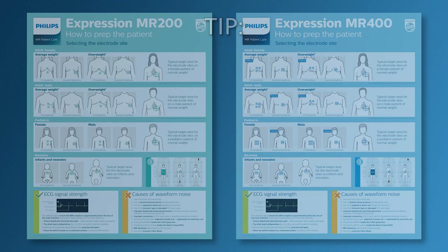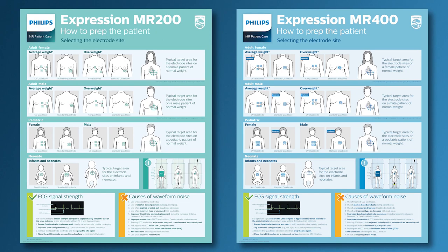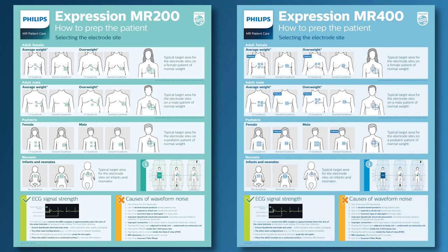Tip: consult the How to Prep poster for above-mentioned procedures and guidelines. Contact your local sales representative to get a digital copy of this poster, which can be placed at the patient prep location or MRI suite.